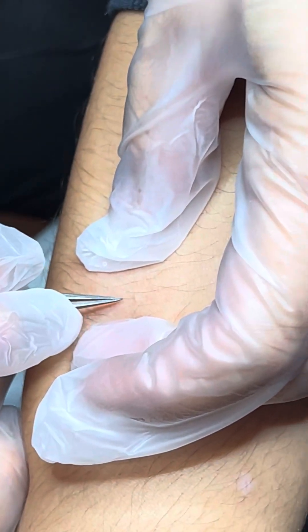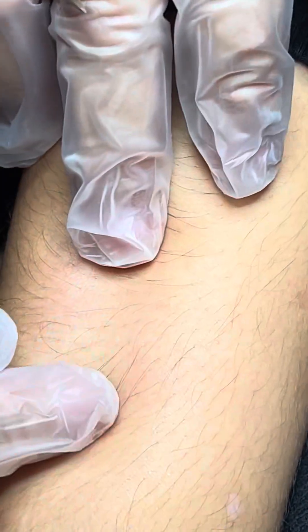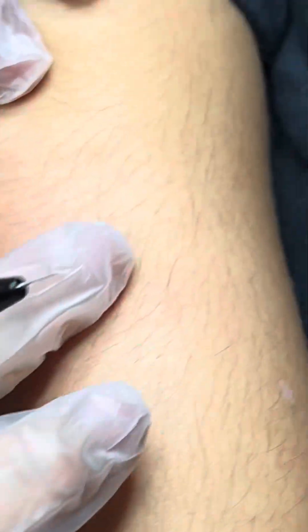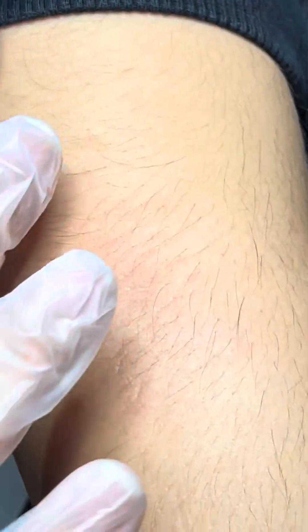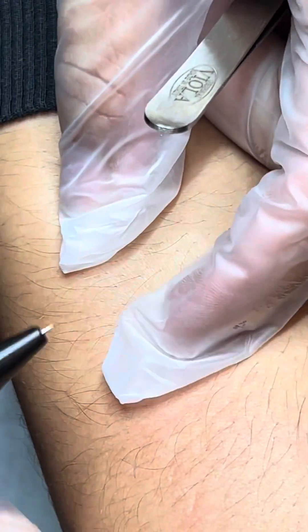Oh my god, I'm starving. That's okay, honey — this is real learning. When I come back, what should you do different? Go a little deeper and make sure you're in the follicle. See how it's red? Go somewhere else where it's not as red. Thank goodness for this — okay, there you go. Good resolution.